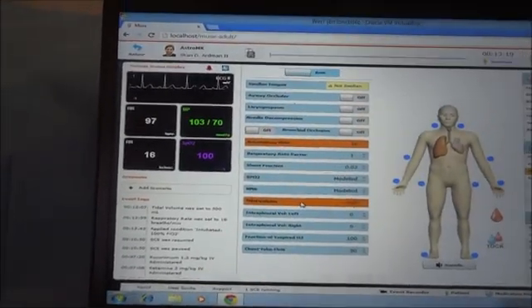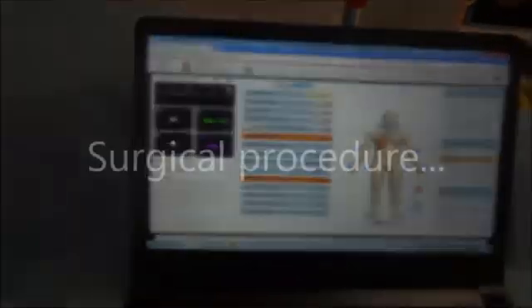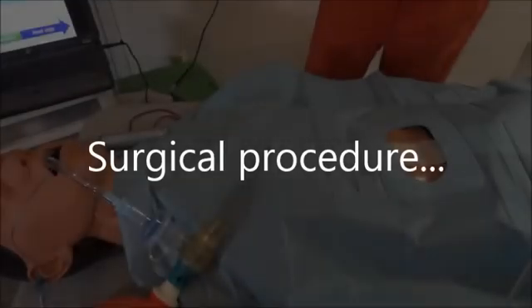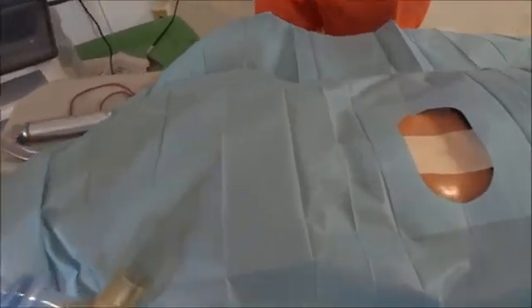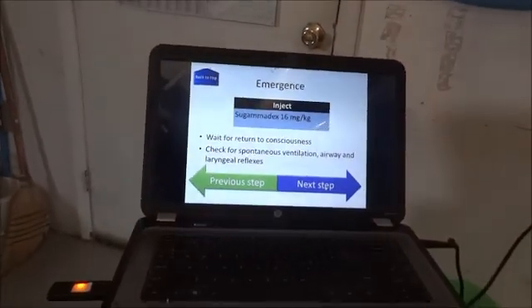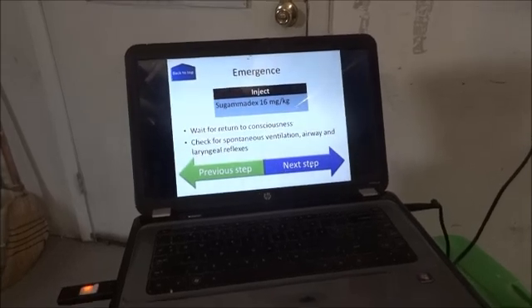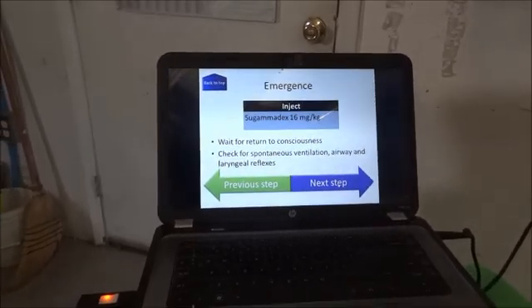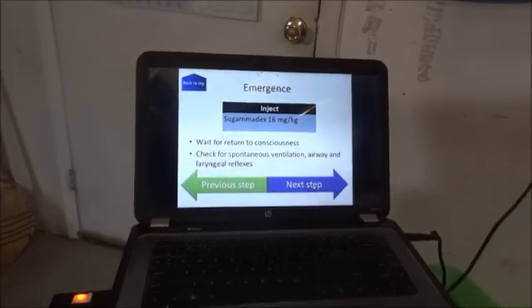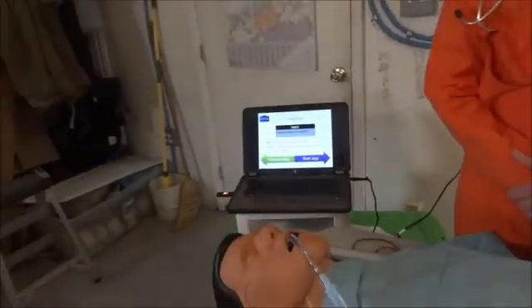He is stable, he's ventilated, and he's ready to undertake the surgery. Now let's pretend that the surgery is over — the patient is still stable, he's not bleeding anymore, and it's time to reverse the effect of the muscle blockers. In this protocol, we've been re-injecting rocuronium every so often just to keep the anesthesia optimal.